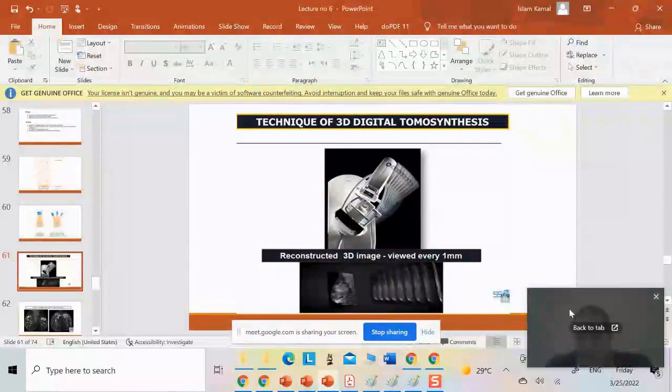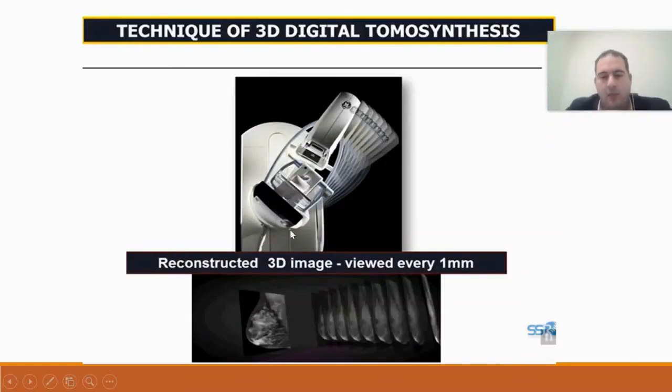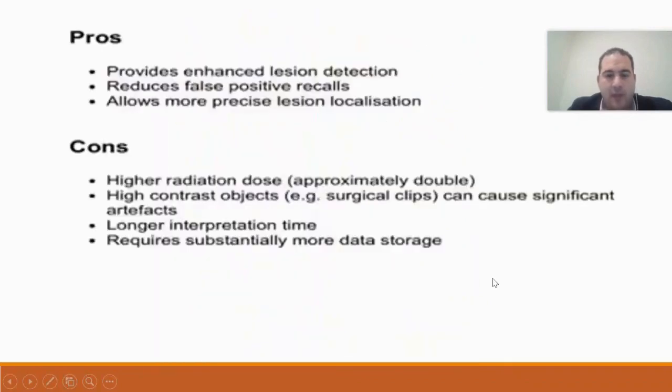As I mentioned, I can obtain higher details by taking different angles. For example, I can reach a certain section or slice. The idea, as I said again, is that I can create a different reconstruction, so there is a difference between the existing devices, which allows me to see them better. As we saw in the examples provided, the examples we take come from many existing devices and several published papers. The importance of tomosynthesis is significant.